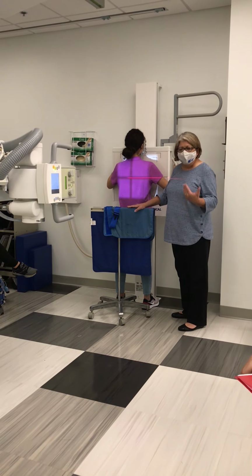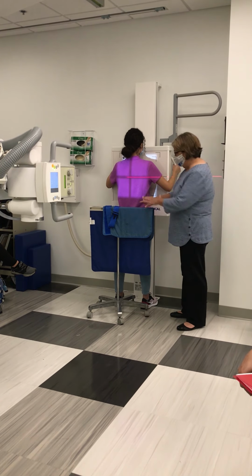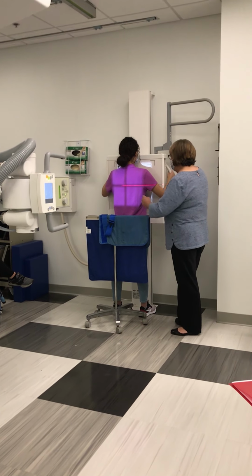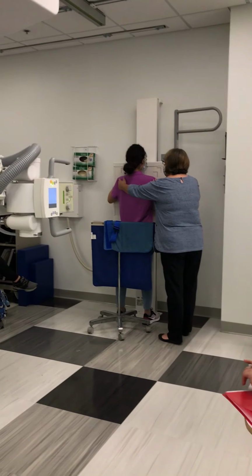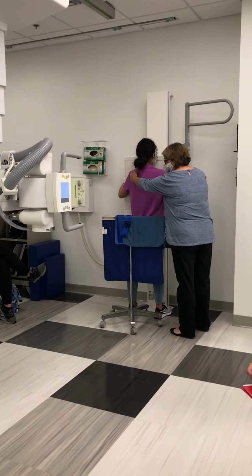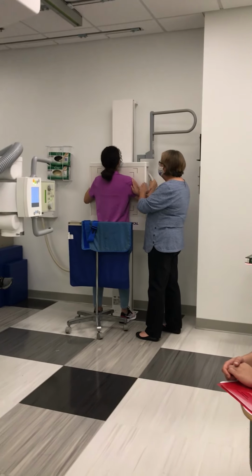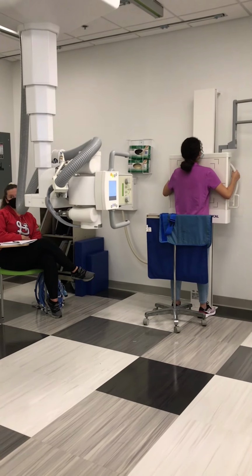Now when you do your simulation, it doesn't matter the height of this. Just make sure that you placed your shield here. Now then I need you to roll your shoulders forward, and you don't just tell your patient to do this, you guide their shoulders forward. Need you to raise your chin, look up. I'm going to give you some breathing instructions.